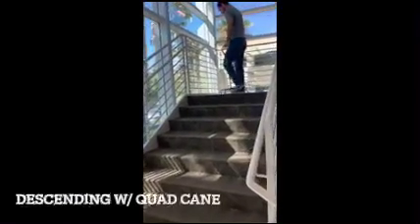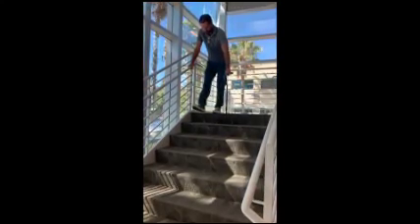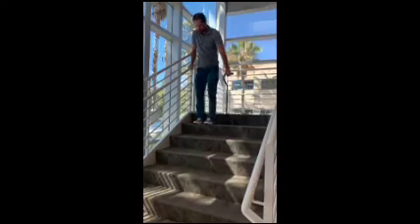Same thing. So if I'm coming down the stairs, we went up this way, coming down. So now I'm going down with my, what first? The stick first, and then the wide part out. Yeah. Affected and unaffected.